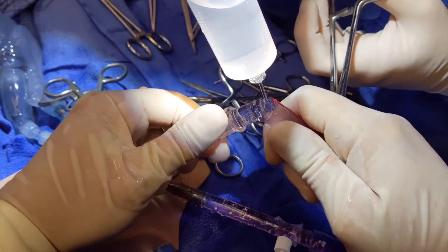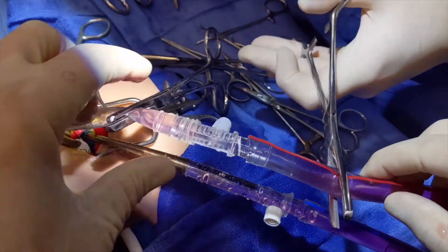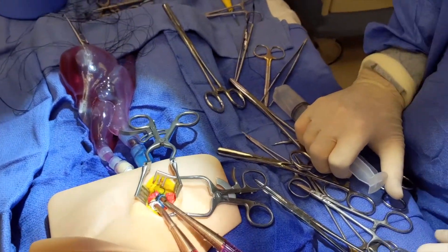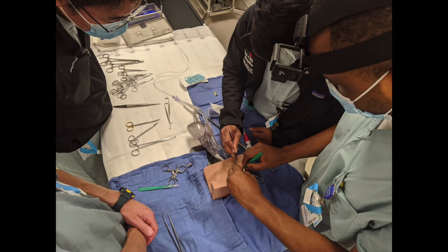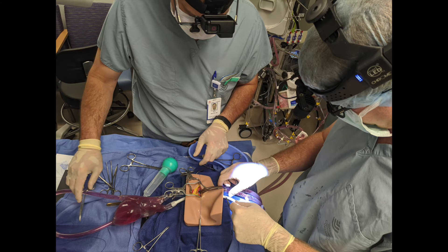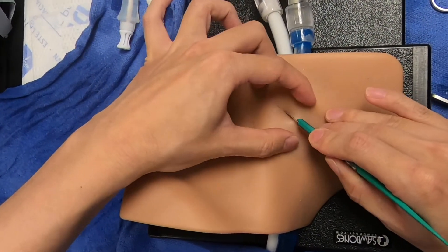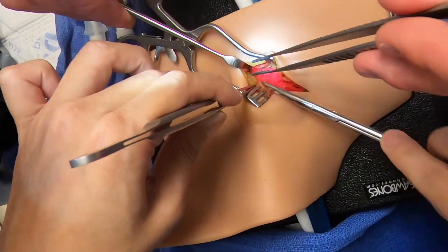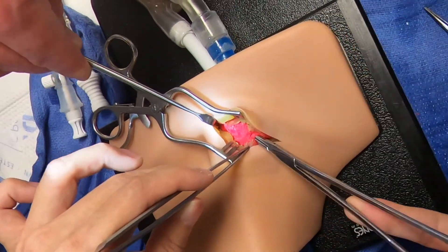Six pediatric cardiovascular and general surgeons rated the trainer good to very good on effectiveness for practicing VA ECMO cannulation and connection to the ECMO circuit, and all six recommended the trainer for skills validation to their colleagues. The final phase will be to complete our pilot in March 2021 while incorporating the trainer at our institution for educational and simulation purposes. The model is currently available for purchase through Sawbones to allow for national and international distribution.